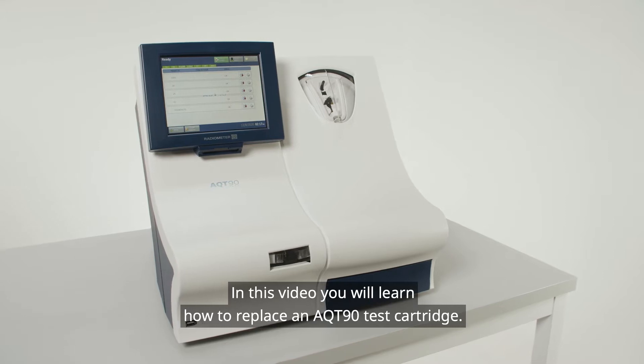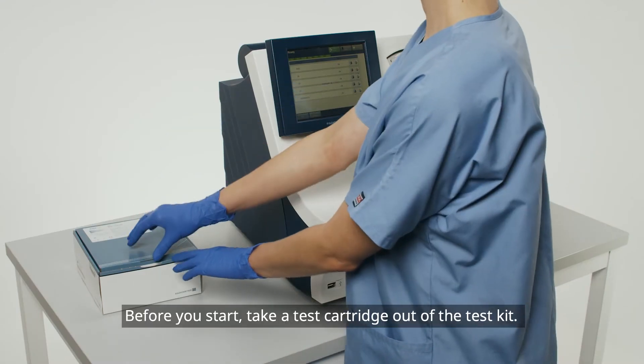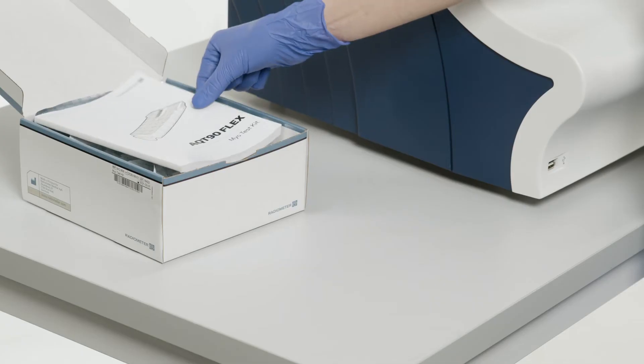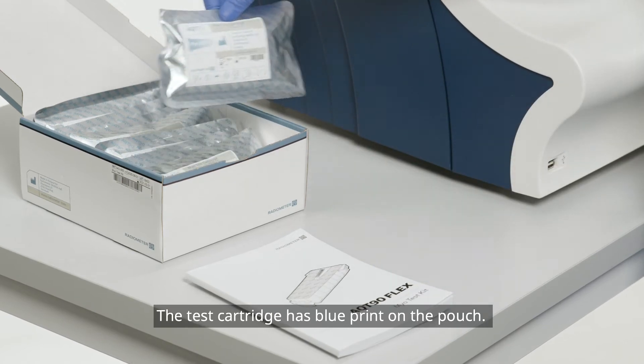In this video, you will learn how to replace an AQT test cartridge. Before you start, take a test cartridge out of the test kit. The test cartridge has blue print on the pouch.